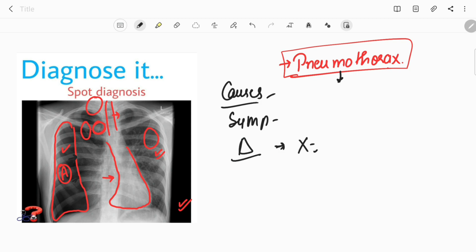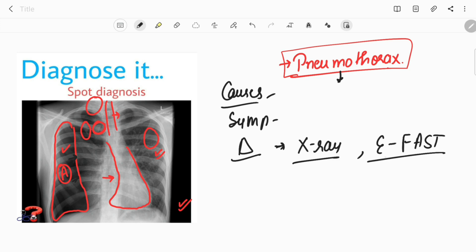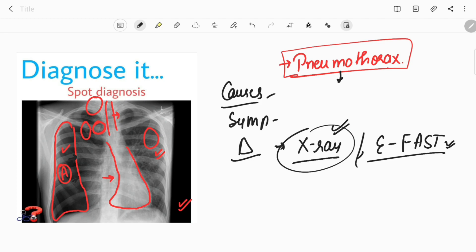For diagnosis, the first investigation is the chest X-ray. Nowadays, eFAST — Extended Focused Assessment Sonography for Trauma — is also used in some places. However, the current investigation of choice remains the chest X-ray. If pneumothorax cannot be detected on X-ray, this is called occult pneumothorax, and CT scan can be used in that case.